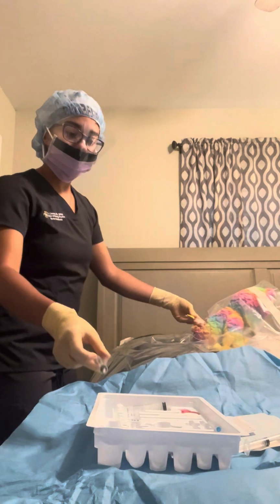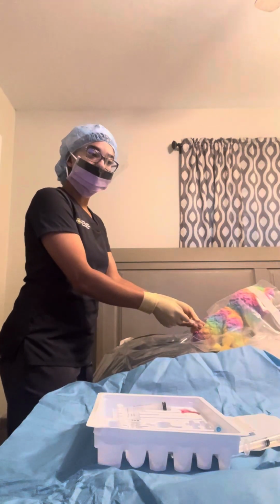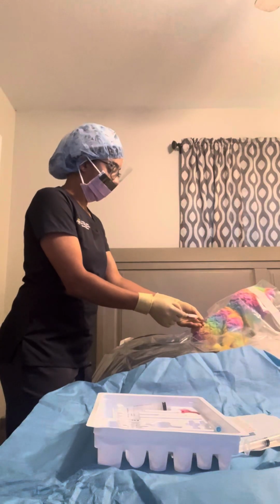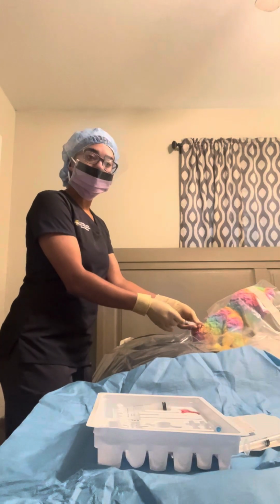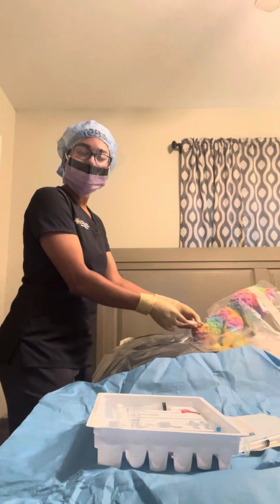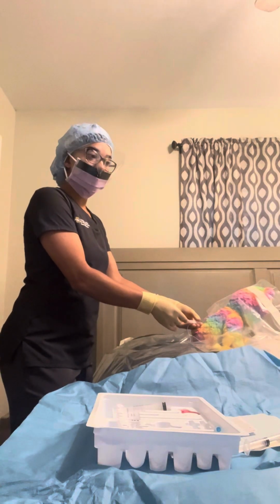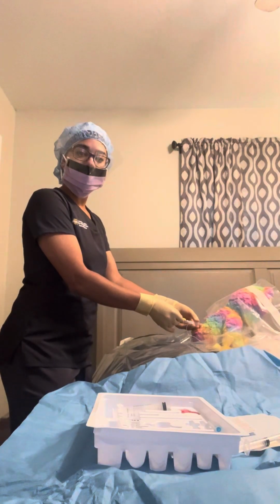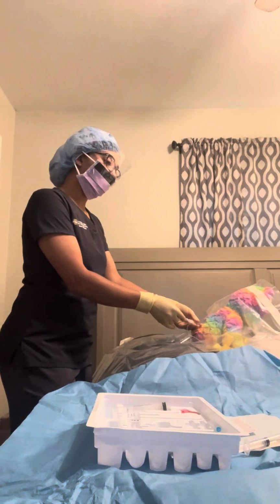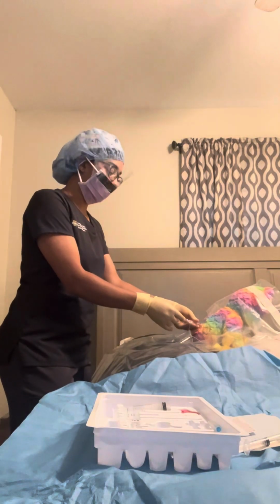After that, I will wait 3 minutes to confirm that it is negative for intravascular or intrathecal injection. If it would be positive for intrathecal injection, the patient would immediately feel motor or sensory blockade. Or for intravascular injection, we would see increased heart rate or blood pressure on our EKG and blood pressure cuff.